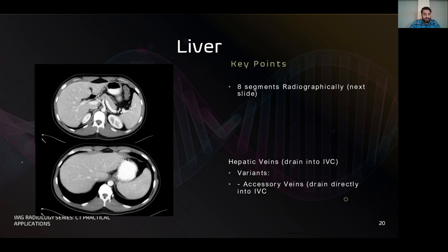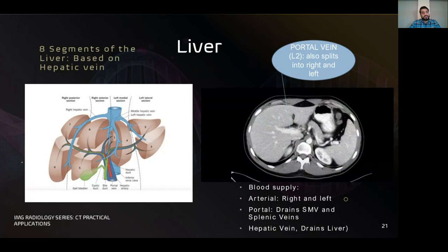That's what the liver looks like on the CT. And you can see that flowing blood will be a bit higher attenuation than the soft tissue. This is the stomach, full of contrast. This is the spleen here. These are your kidneys. And here you can see a little bit of the pancreas, which hugs the splenic vein. So as I said, the liver is split into 8 different segments.